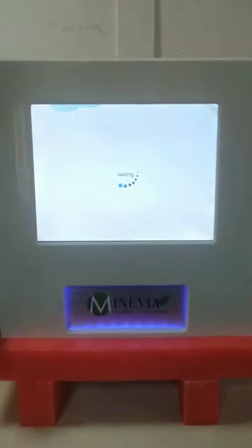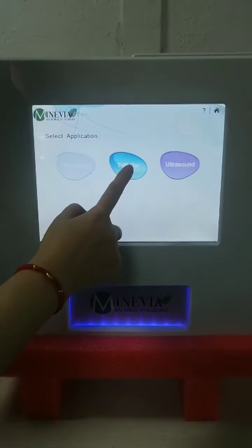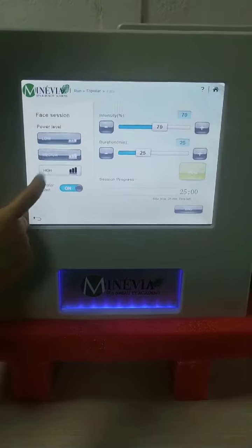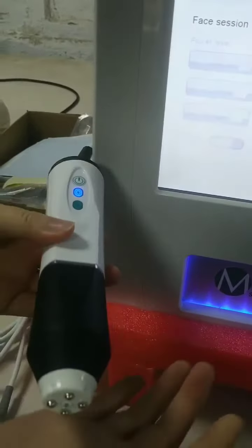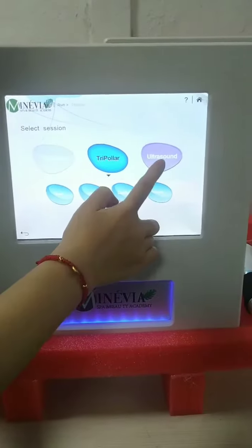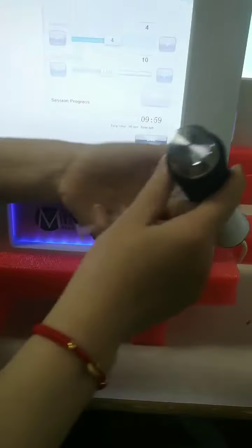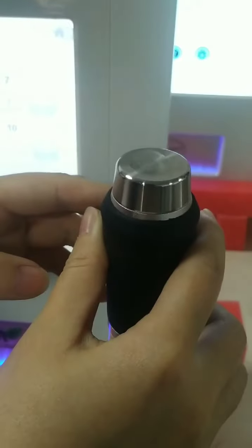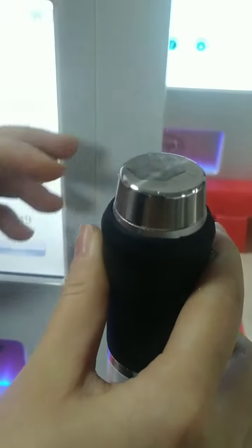We test the machine now. You can see the machine screen logo and the body logo — it's really cool and very beautiful. This is the RF handle. Let's move to the ultrasound. It's really cool and strong power.